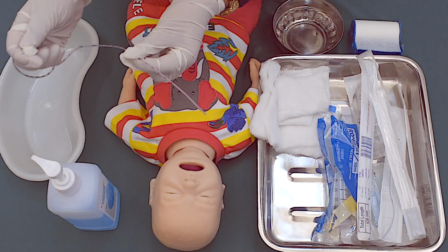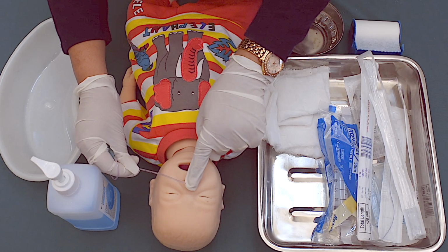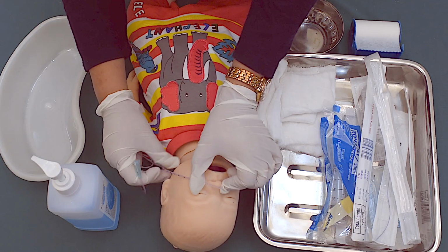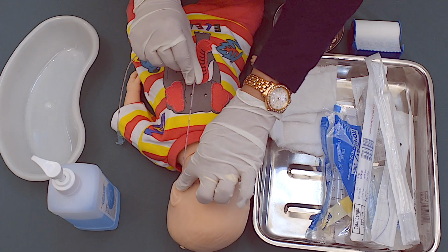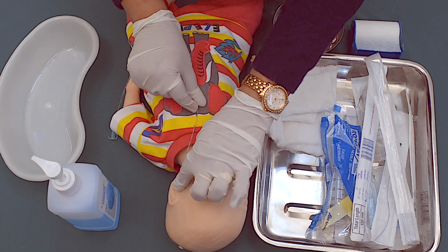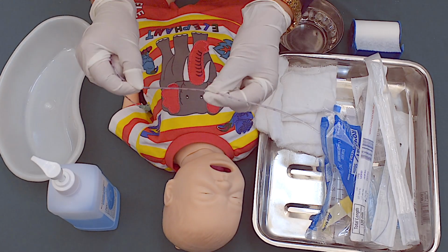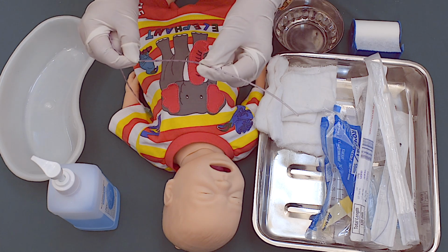This tube has to be measured from the tip of the nose to the earlobe and from the earlobe up to the xiphisternum. So this is the length of the tube that is to be inserted from the nostrils or from the mouth of the baby.